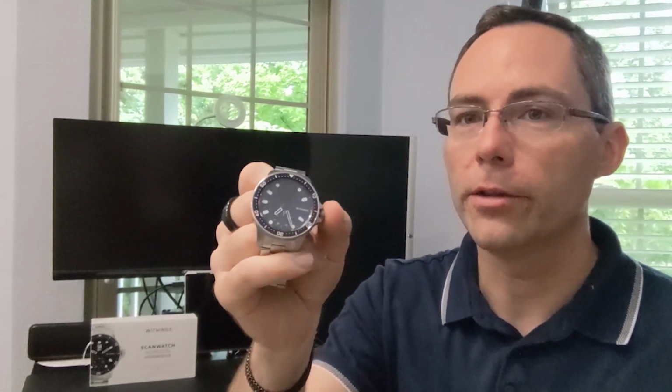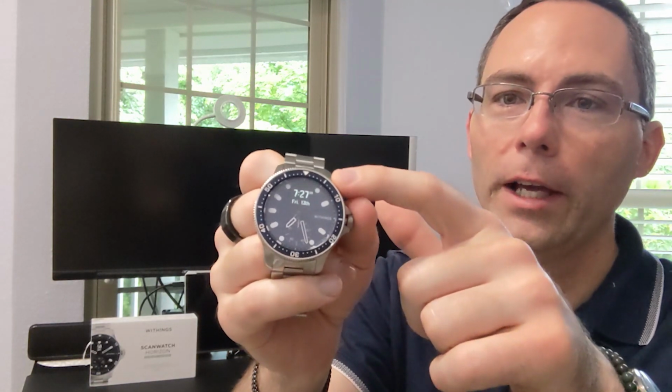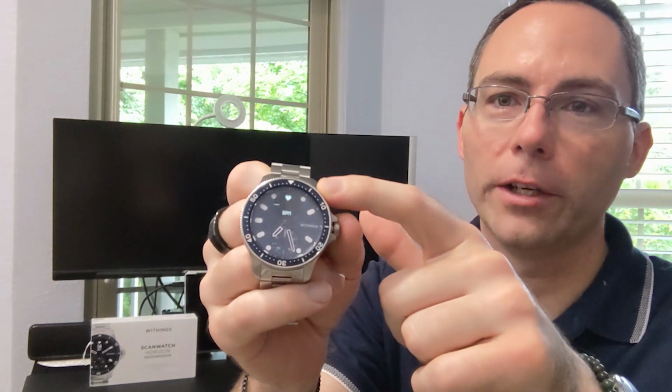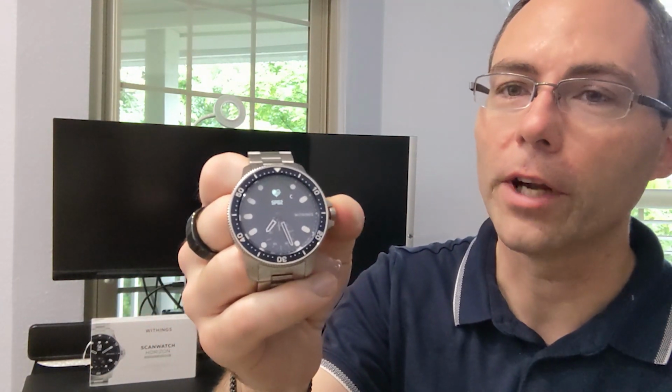As far as the functionality of this watch, the interface on it is pretty simple. It's entirely done through the crown on the side here. You press it in, turns on the screen, and as you roll the crown, there it's checking heart rate, giving the number of steps, and you can just kind of scroll through and see all of the different options it has on here. This is how you access checking your blood oxygenation, the ECG, all of that.